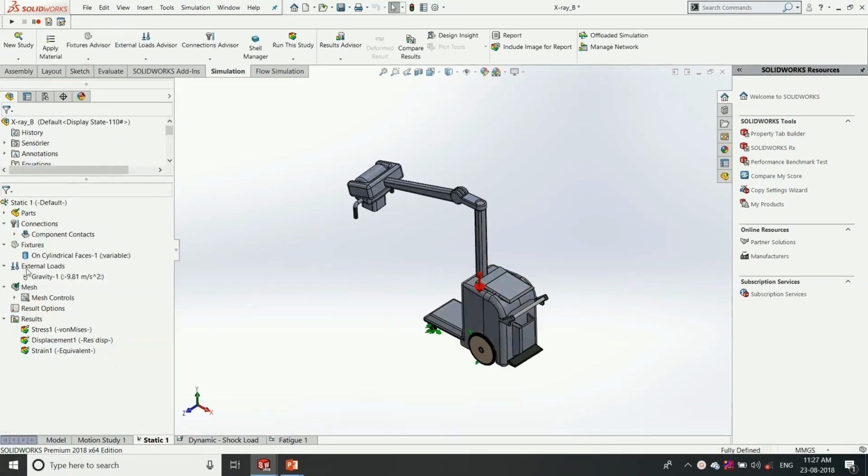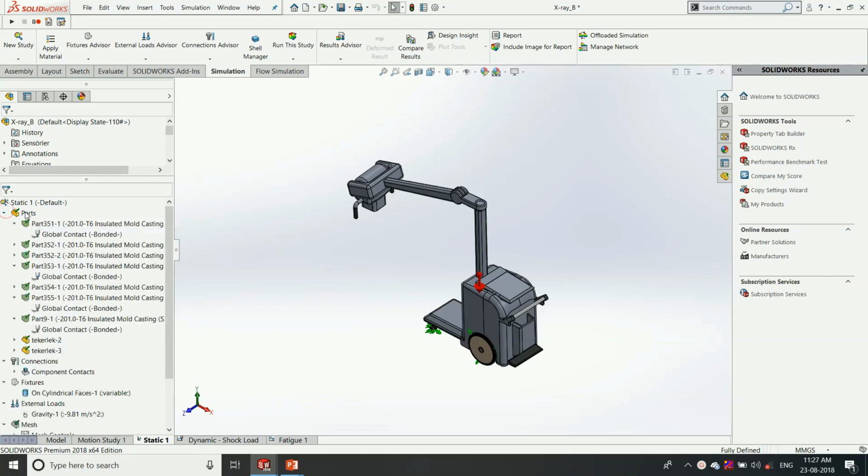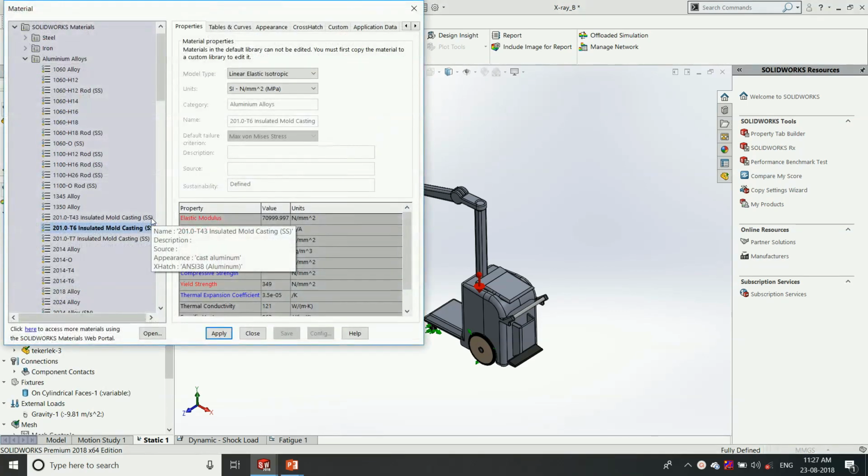So in the static study we can define the material properties, which are already defined here. So we just need to choose what type of material we are going to use in the product. So here I chose a mold casting insulated T6 material. So according to this material, the material properties will be aligned here: elastic modulus, Poisson's ratio and mass density.